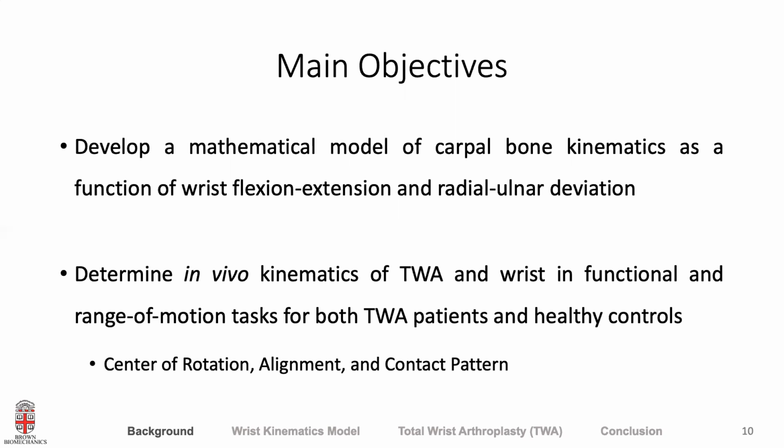After checking the assumption, I designed an in vivo experiment to look at the overall wrist motion of the wrist and total wrist arthroplasty. I decided to specifically look at the center of rotation, the role of alignment of the components, and the contact pattern of the components.